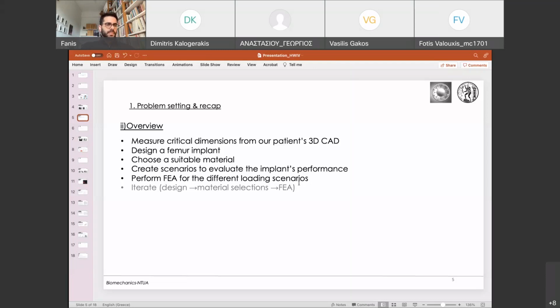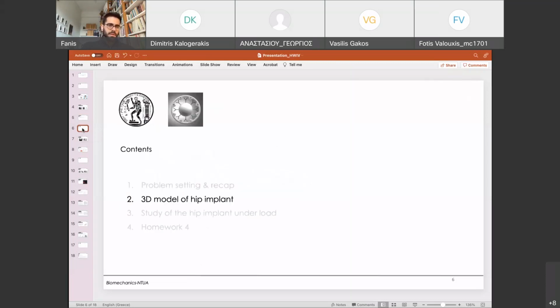Usually, if you had a project like that in a more real life scenario, you would iterate these steps again and again until you get a solution that is sufficiently good. We're not going to do that, but it's good to know. So first off, let's see how we can design a 3D model of the hip implant.